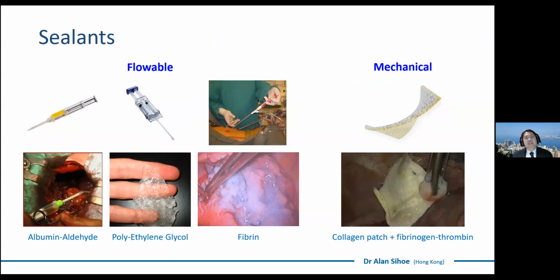So hopefully what we're going to see is why sealants are useful in this environment, where post-operative interventions are probably a bit too late, and other intraoperative interventions are probably not ideal. If you have a sealant, wow, simple solution, cheap and easy. You slap some glue onto the air leak and hey presto, you've solved the problem. So do these actually work?